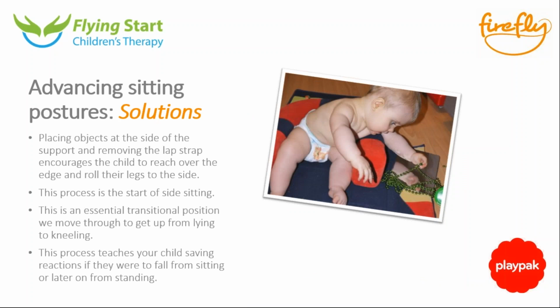Then from that we can work on even more advanced sitting, which is side sitting. We need side sitting to get ourselves up from lying to sitting on the floor. It's a really good transitional position because we'll go through side sitting when we get into kneeling, when we get into crawling, in all sorts of positions. So it's a really useful position. Even if we're never going to independently learn it, we can still practice it and gain as many of those skills as possible. Here we've got the beads and mirror to the side. He loves himself, he loves the mirror.